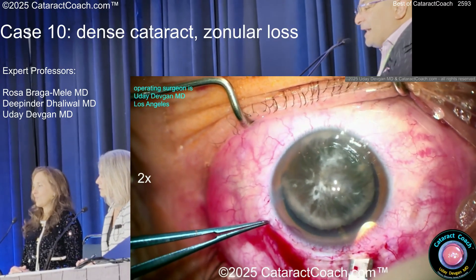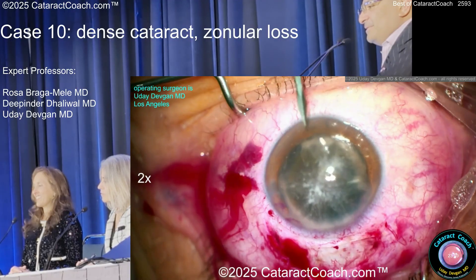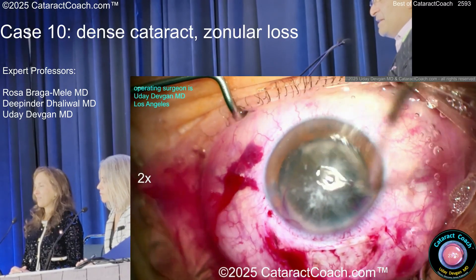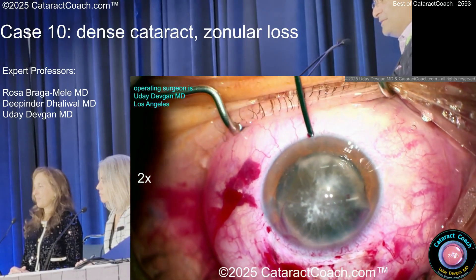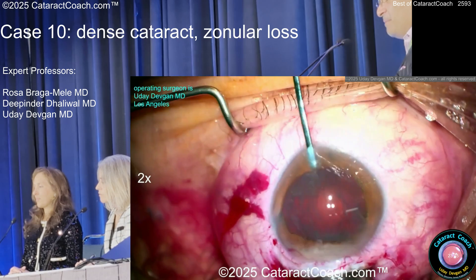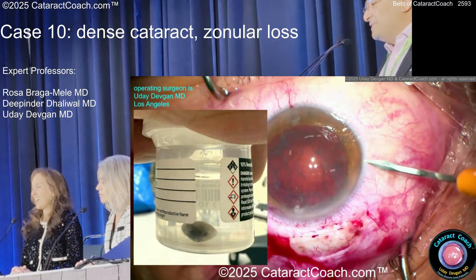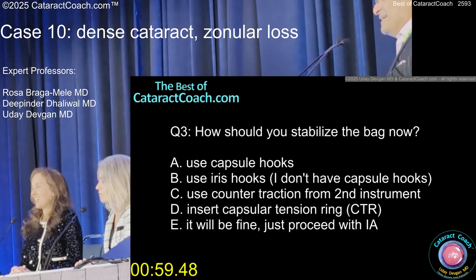Whatever I think is big enough, I go back and make it a little bit more, and a little bit more — because I'm always wrong. There's the opposite paracentesis. The cheat code: I put the lens loop in — notice the whole nucleus is on top of the iris, which is where I want it, not on top of the capsule. I just push it out. Like delivering a baby — boom, there it is! It's a diamond!